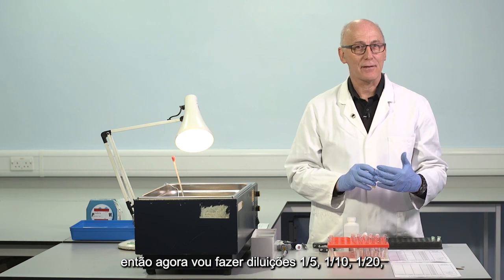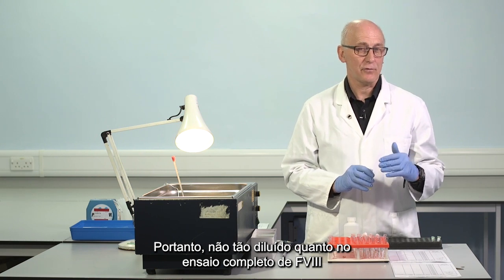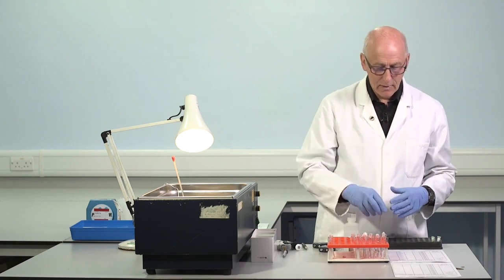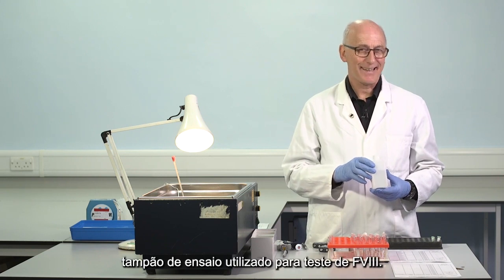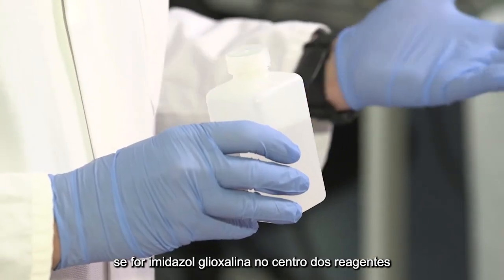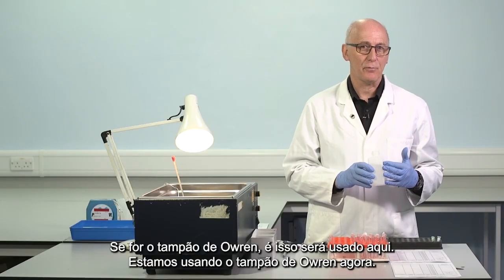So I'm now going to make dilutions 1 in 5, 1 in 10, 1 in 20. So not so diluted as the full factor VIII assay might have been. So 1 in 5, 1 in 10, 1 in 20. These dilutions are constructed with the same assay buffer as used for factor VIII assays. If that's imidazole glyoxaline in the centre for the reagents, that's what should be used here. If it's Owren's buffer, that should be used here. We're using Owren's buffer just now.